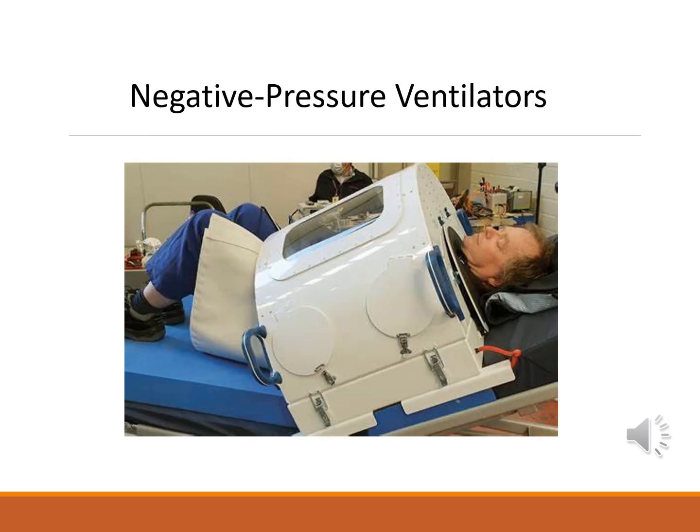Negative pressure ventilation is less common. This type of device surrounds the chest with lower pressure to draw air into the lungs. The main difference is in how each method supports or replaces a patient's natural breathing.